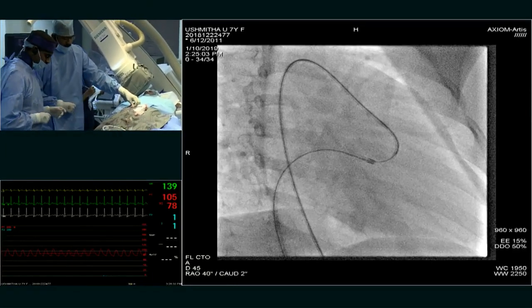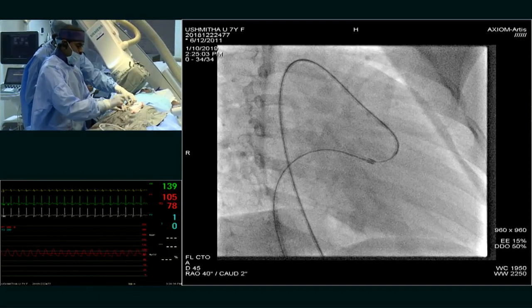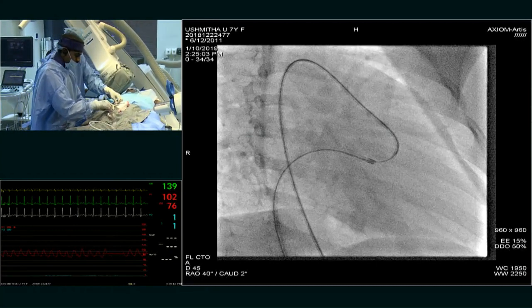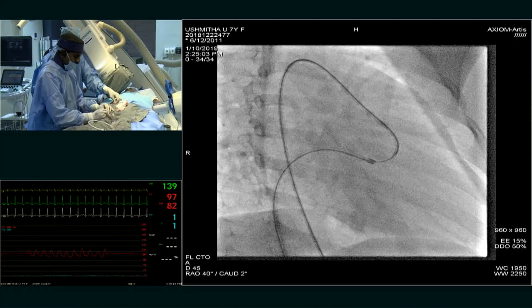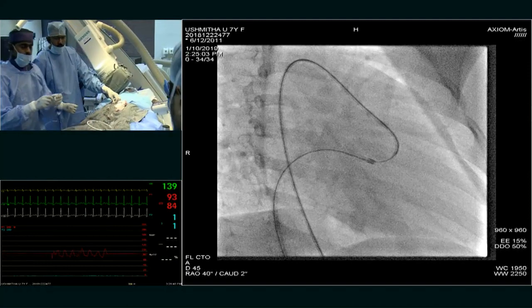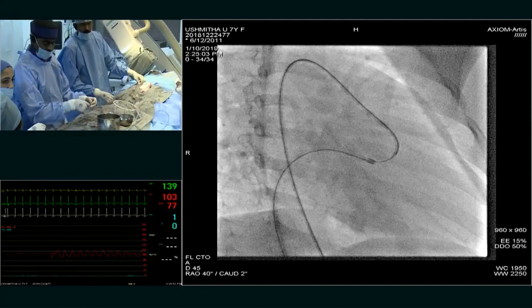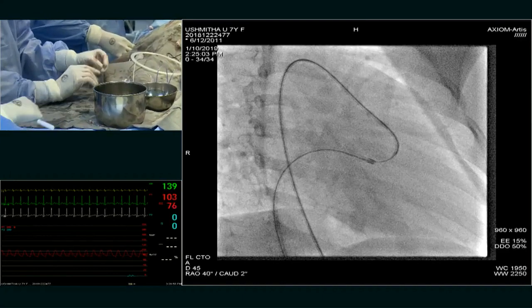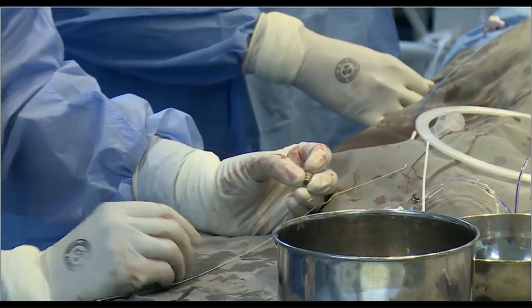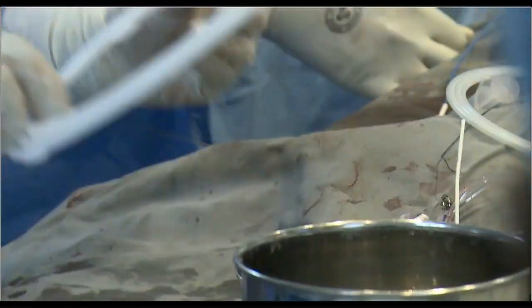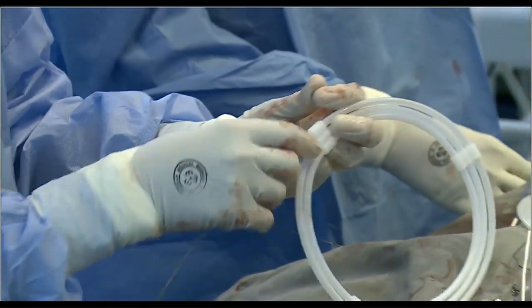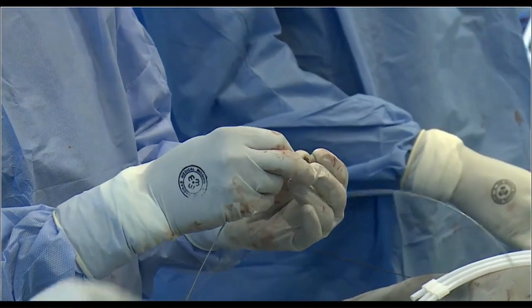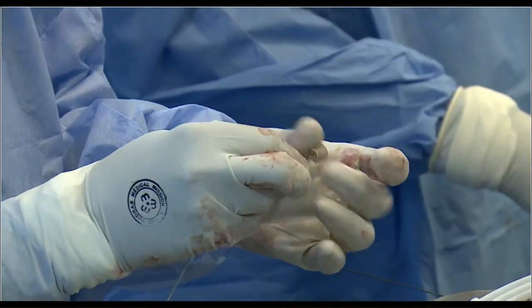Now, I understand Dr. Jo Kim telling me to retain the sheath like a guide wire. But one of the problems I might face is I may not have space. If the whole thing backs out and I end up in the aneurysmal sac, then that's okay.